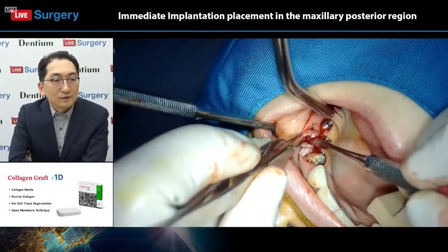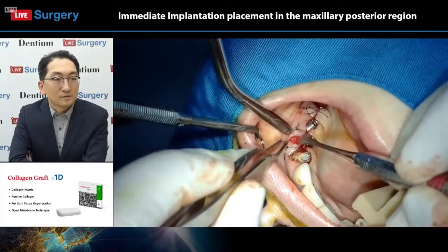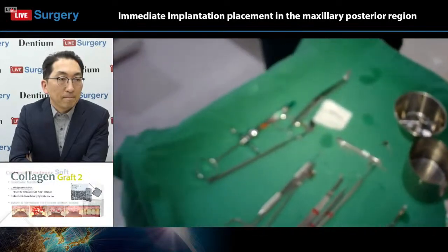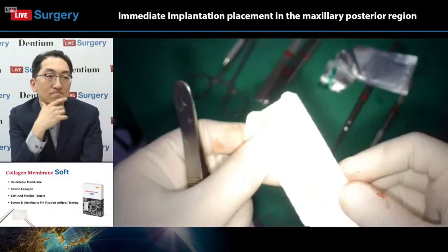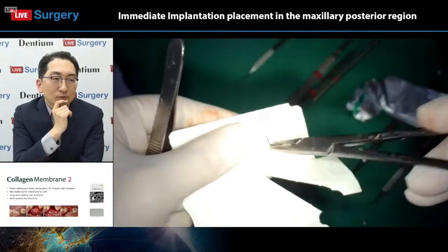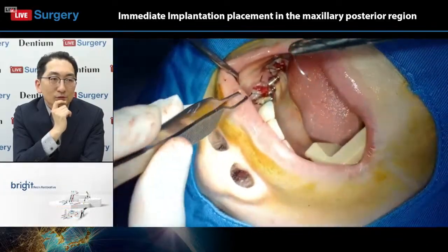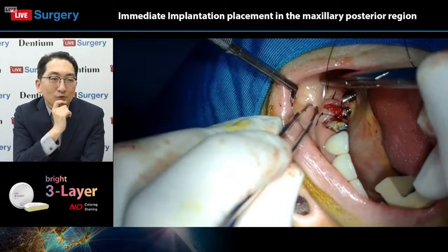I tried to fix the collagen graft. I used one more silk suture.